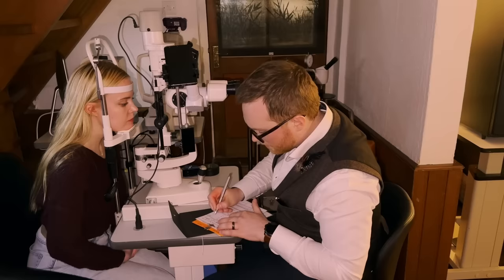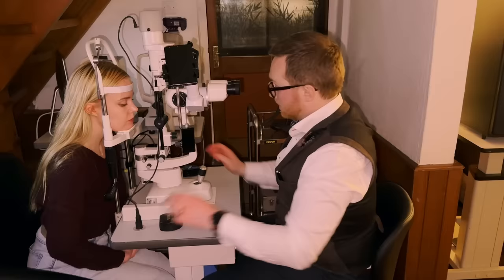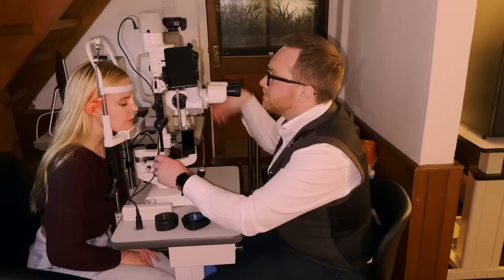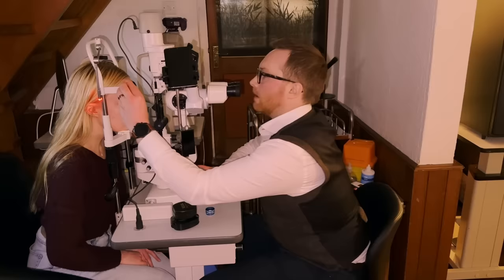Right. So that I can get a good view of the back of your eyes, I'm going to hold some little lenses up in front of you and they just magnify the view at the back of your eye. It does make the light a little bit brighter, so if it is a bit too bright, just let me know. I'll turn that down a little bit for you. Okay. So what I'm going to get you to do is have a look past my right ear for me. That's very good.